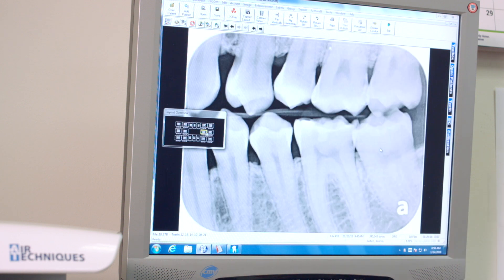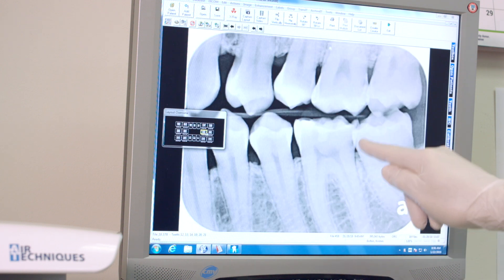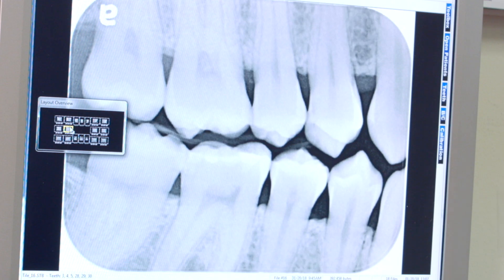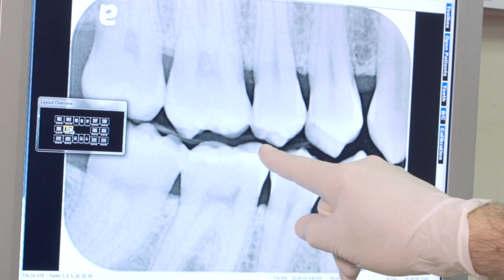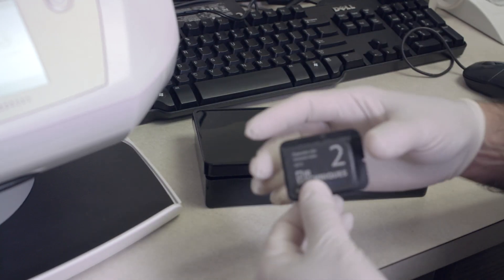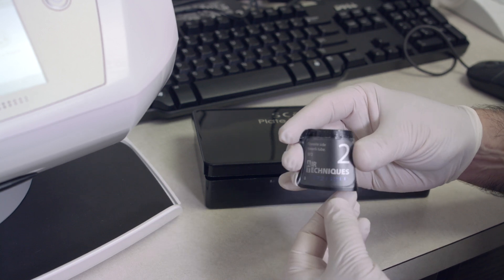The image quality is outstanding, providing up to twenty line pairs per millimeter. Unlike sensors, phosphor plates have no borders, giving you a much bigger image. They are more flexible, easier to place, and less expensive. Phosphor plates use standard holders — nothing new to purchase.